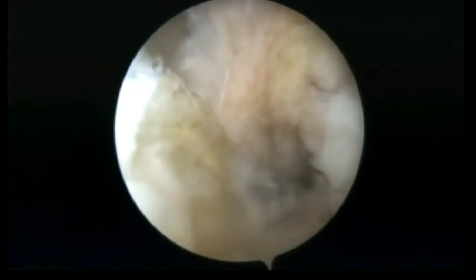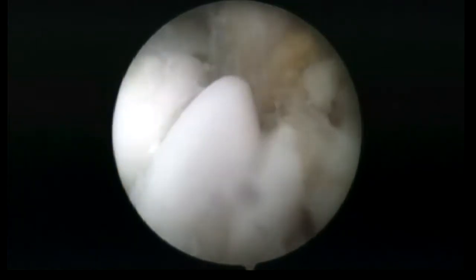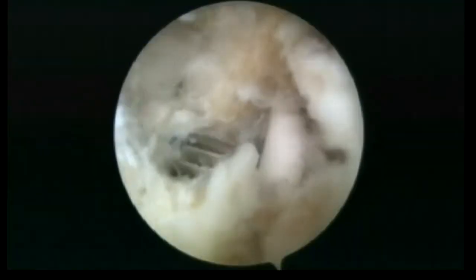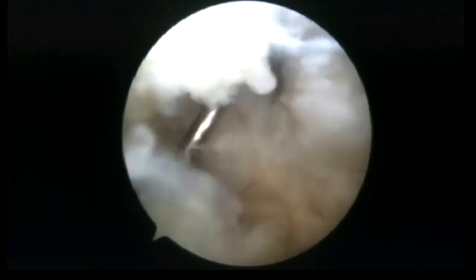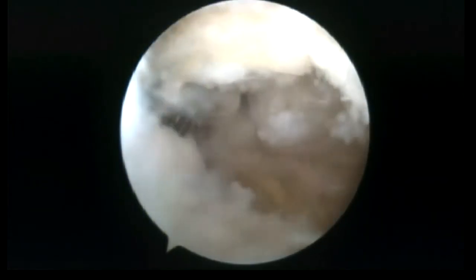When the correction is accepted, the first biocomposite interference screw, introduced through the posterolateral working portal, is placed in the bony defect underneath the posterolateral fragment of the tibial plateau. Then the arthroscope is moved through the anterolateral viewing portal to the lateral recess, and the second biocomposite interference screw is placed underneath the posterolateral fragment through the mid-lateral portal.